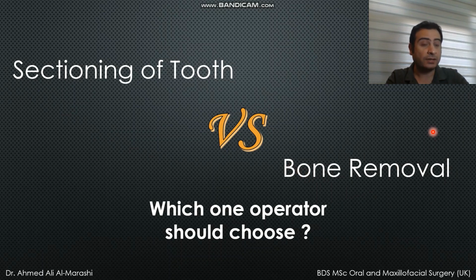So after we finish the surgery, we can have the tooth, but the bone needs to remain within for the patient. So we remove as little bone as we can, and we section the tooth into a reasonable number of pieces. Okay, so within this balance, we hopefully have a procedure that has minimum mortality and morbidity.